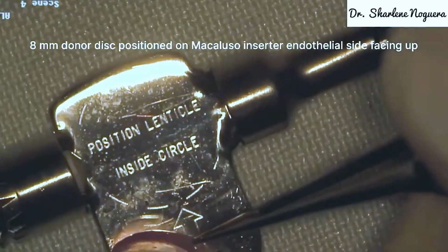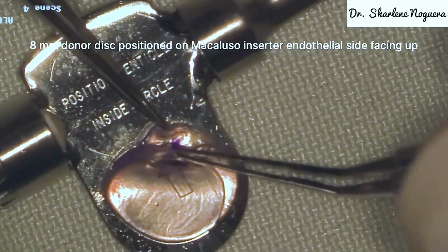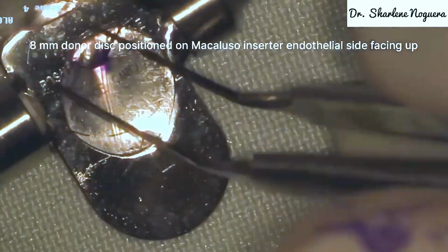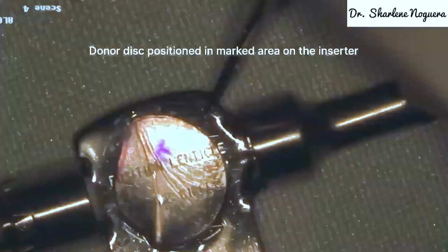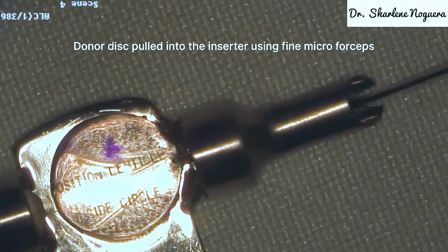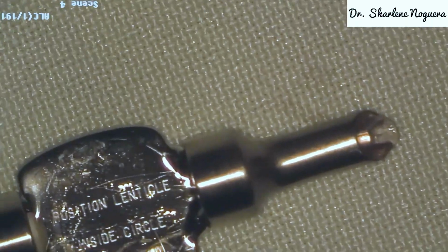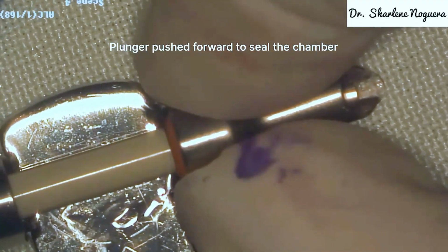The 8 mm donor disc was positioned on the Macaluso inserter with the endothelial side facing up. The donor disc is positioned in the marked area on the inserter. Then, it is pulled into the inserter using fine microforceps. The plunger was pushed forward to seal the chamber.